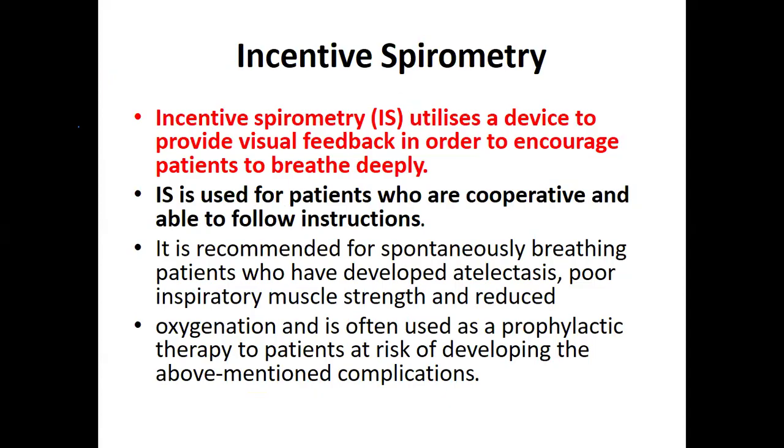So there is also a technique known as incentive spirometry, or spirometry. Spirometry is a process that studies the breathing, the whole technique that records the breathing process as a whole.